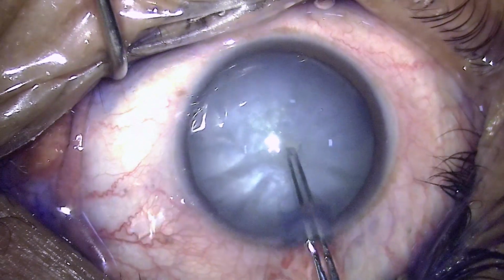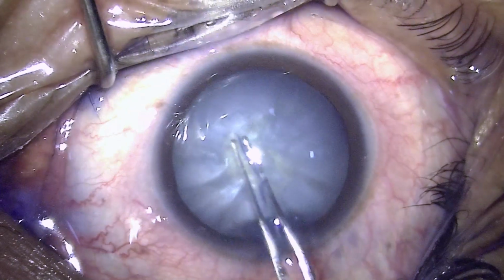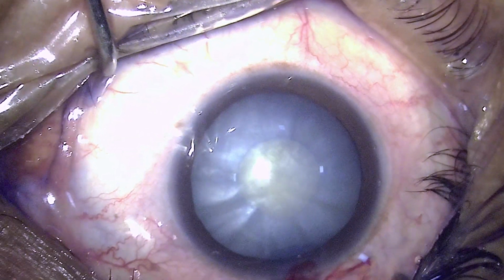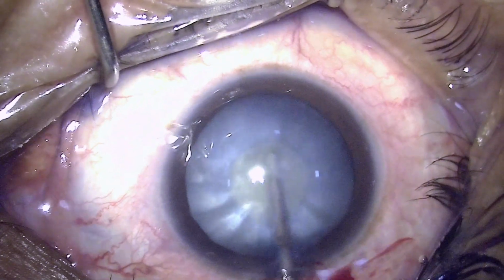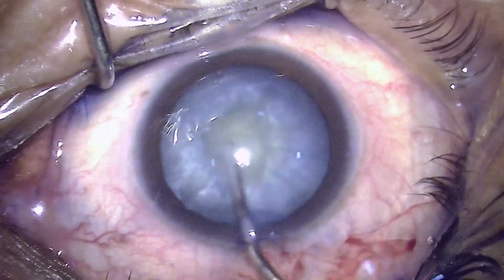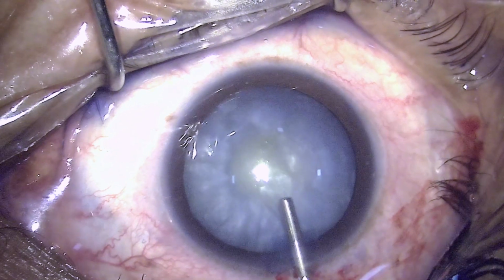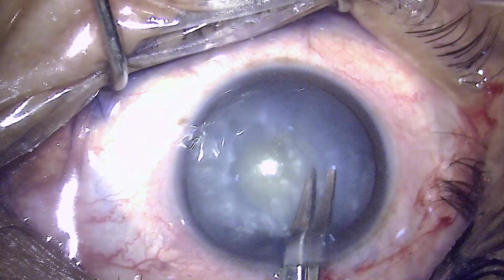So if we make a small rhexis in the center first, as is being created, this will allow us access inside the capsule into the lens matter, and then these lakes, which are actually the causing problem, can be simply disintegrated, and portion of the volume can be reduced, and this will reduce the pressure or the turgidity of the capsule, and then subsequently a comfortable, reasonably sized rhexis can be done without fearing that it will extend into the periphery.